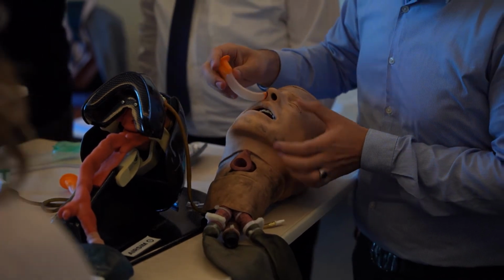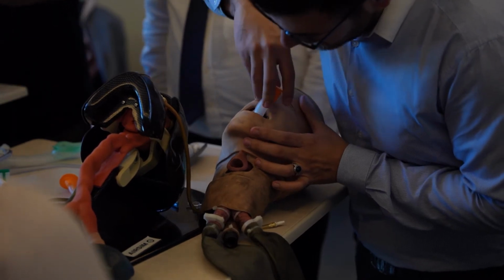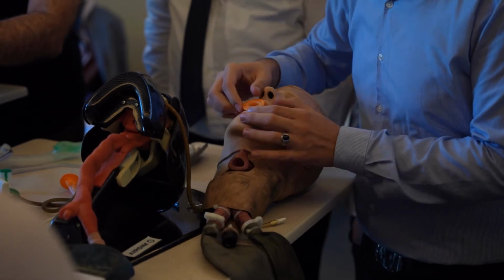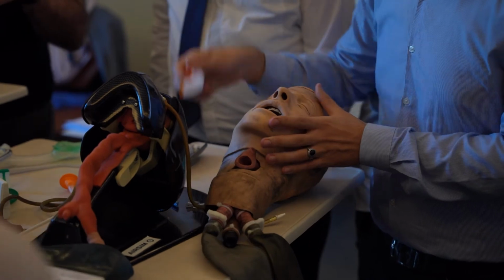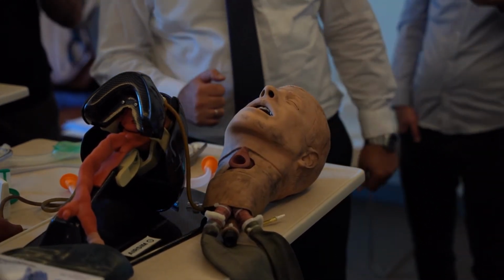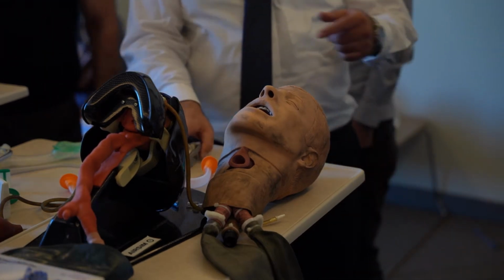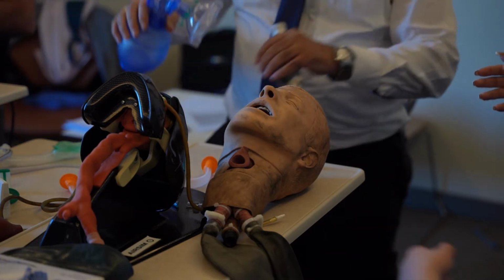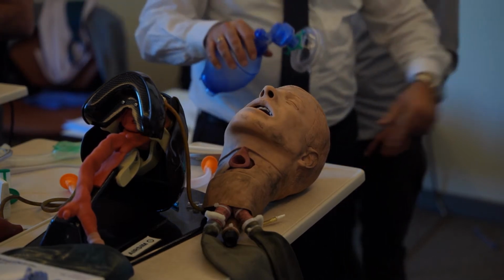If you are two persons, you are going to hand the bag to your colleague, and by manual ventilation you use C and E. This is more tight, more fixed, and with less air leak. All of you should know how to handle the C and E and fix the area. I think most of the junior doctors and staff don't know how to hold it. This is the way of learning.